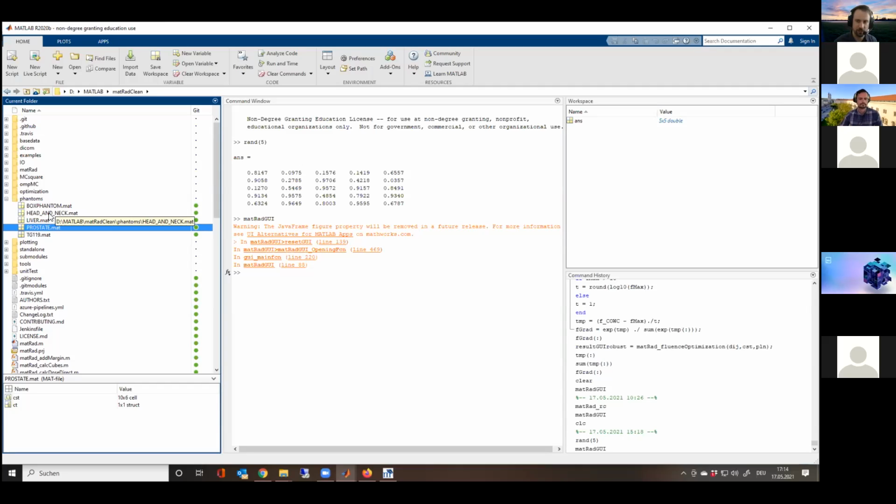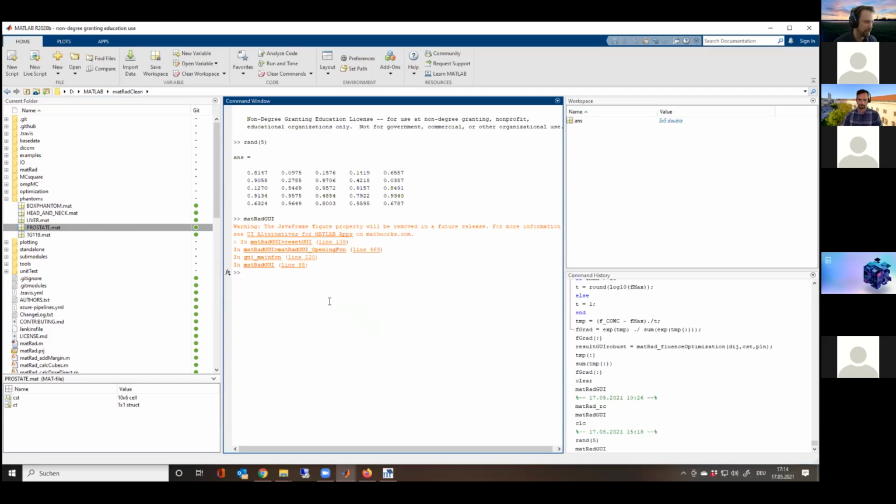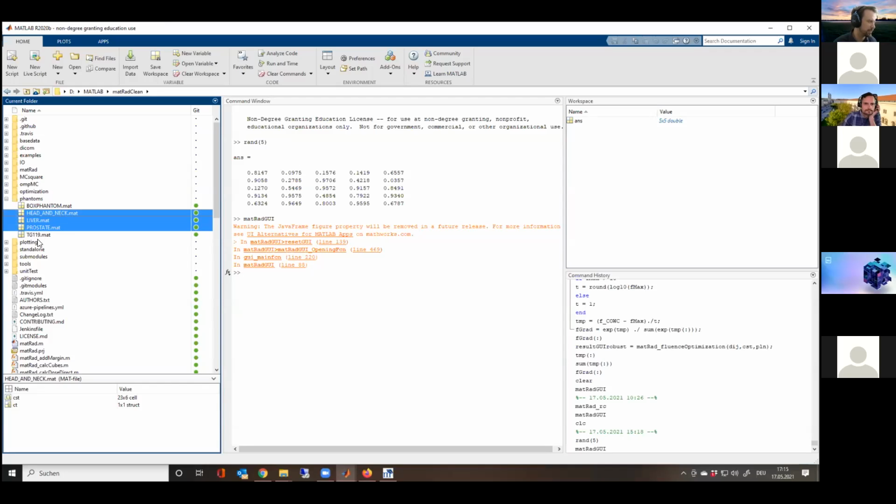It was artificially added afterwards to make a set for treatment planning, because it's regulation-wise easier to provide an open data set from a voluntary healthy patient than from a voluntary sick patient. I think that was the idea behind it, but you can read the publication on the CORT data set. It might also be a little bit different than what I say, but those are the patient phantoms, let's say.